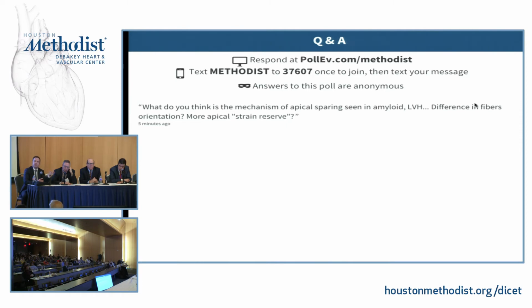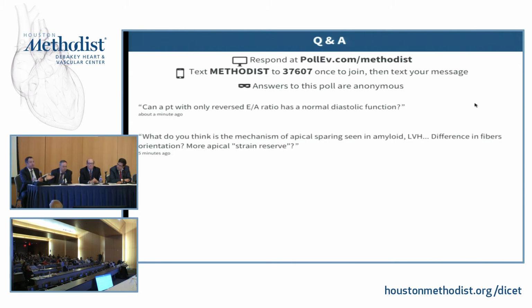You are going to have vomiting, you're going to have diarrhea. And just like Miguel mentioned, with ejection fraction, which is absolutely load dependent, guess what? Strain imaging is exactly the same. You are preload and afterload dependent. The very first thing that we teach our fellows is that just like when you are reporting gradients across the mitral valve, the next question always is, what is the heart rate? The same thing happens with global longitudinal strain. The same question is, what are the loading conditions? You always need to report the blood pressure.